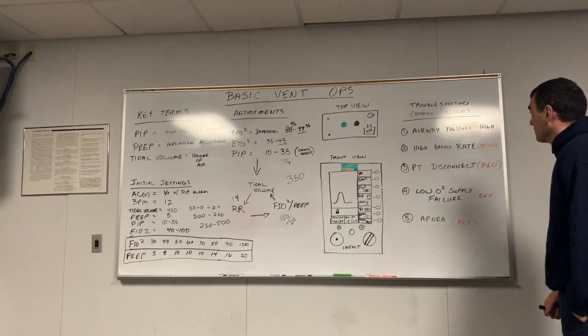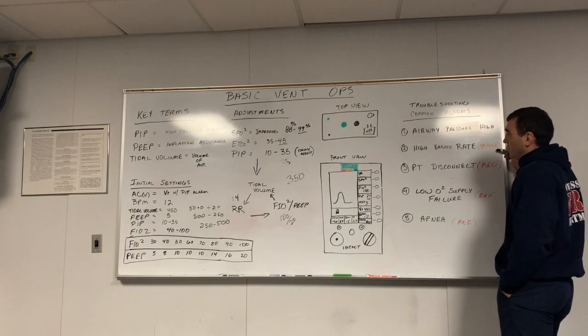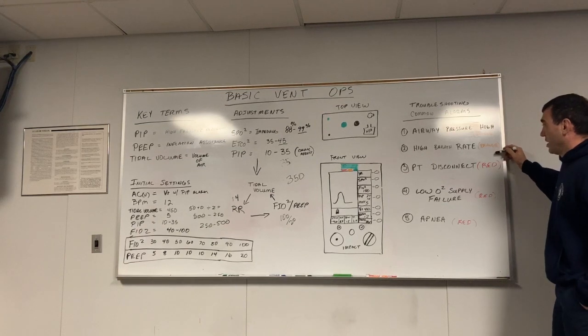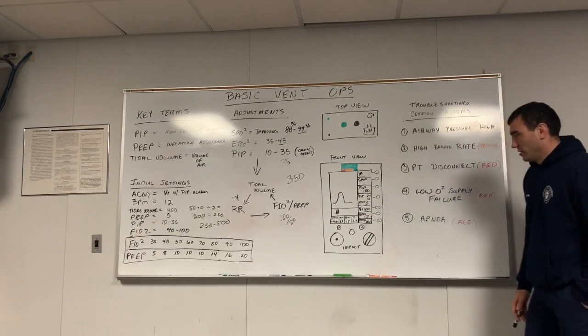Okay? Second one, high breath rate. Okay, this is a common one. I've had 2 or 3 calls here recently about this one. Okay, I was going to the hospital and it kept alarming and telling me I had a high breath rate, but when I looked at my breaths per minute, it wasn't high.